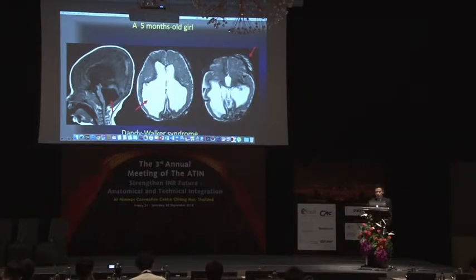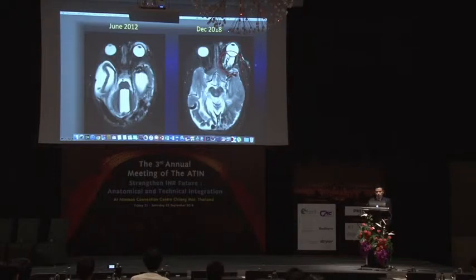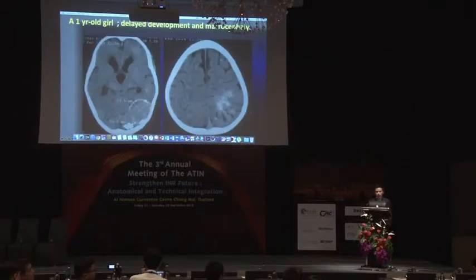And often we can see this lesion in the scalp. This is a venous malformation. It can be associated with dural AV shunt in children. After follow-up, 6 years later, you see a new venous malformation lesion also. It occurs in the orbit on the left side and can cause proptosis of the left eye, and sometimes it compresses the optic nerve.